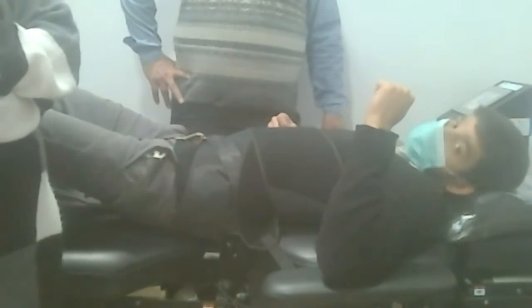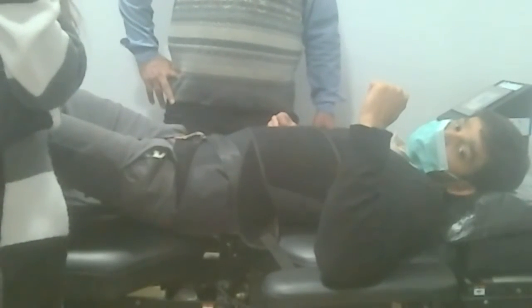Mr. Patient, are you feeling anything? Yeah. Okay. It's pretty gentle. It's pretty subtle. So don't let patients dictate that they should be feeling more, because really what you don't want is for the muscles to guard or go into spasm. You want the patient to be nice and relaxed.